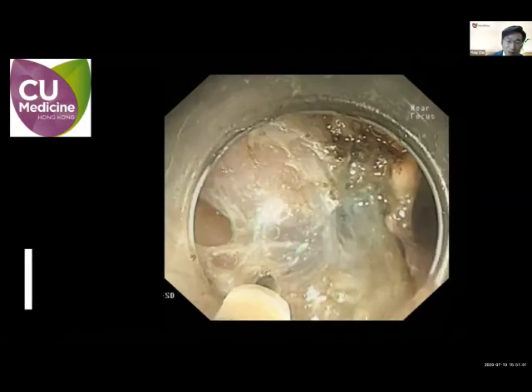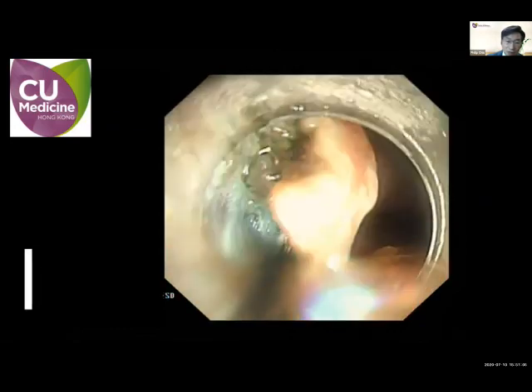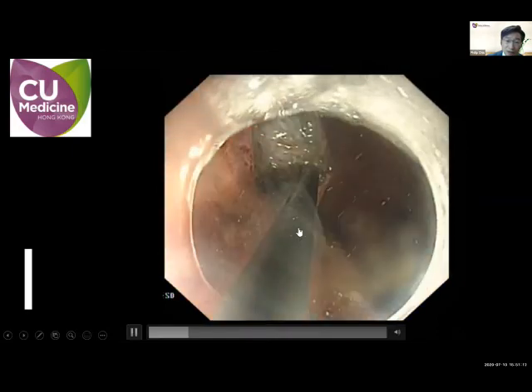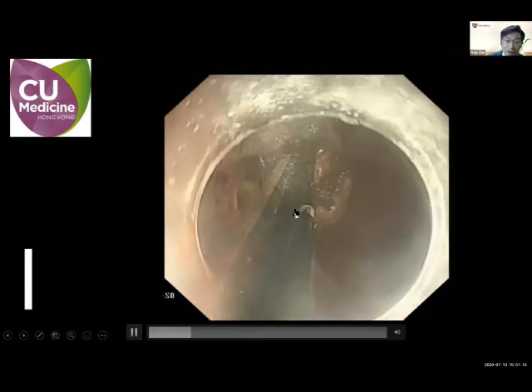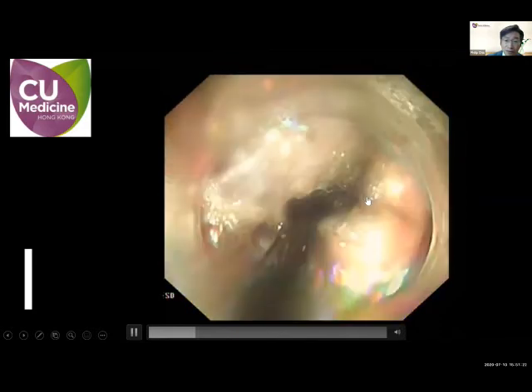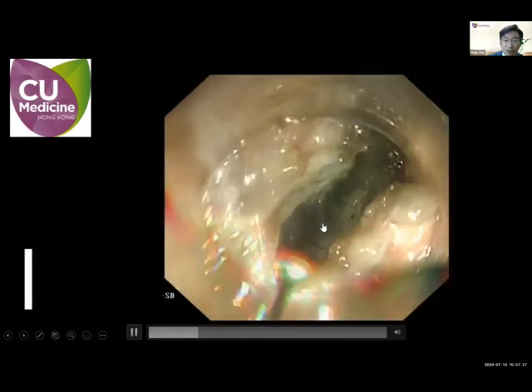So I'm pretty sure that we need a good dissection of the muscularis, and all the time it ends up in full thickness incision. So I use both the dual knife and also the IT knife for the dissection. As you can see here, I also mobilize the tumor, and sometimes cut the tumor to preserve some of the mucosa to enhance the closure.